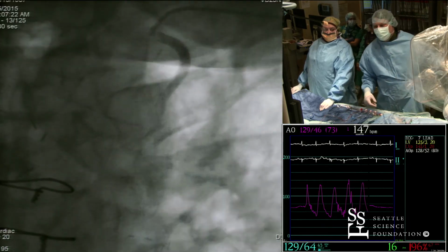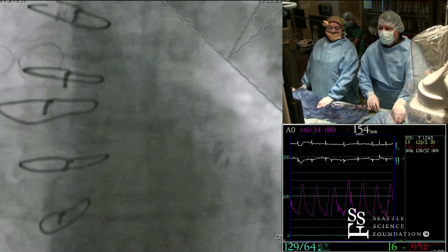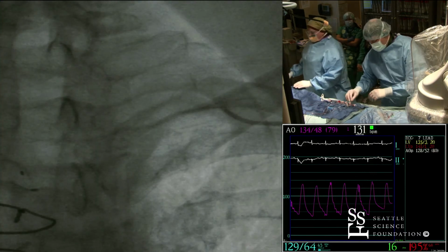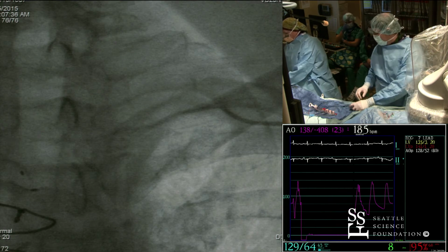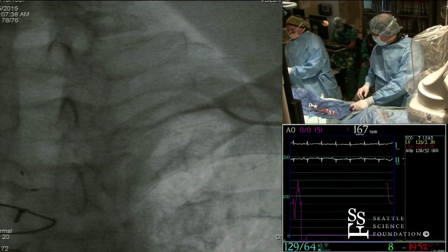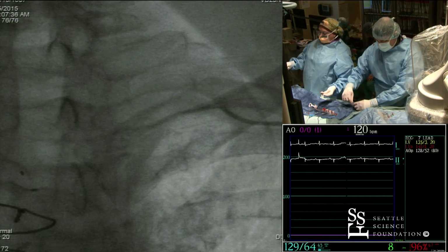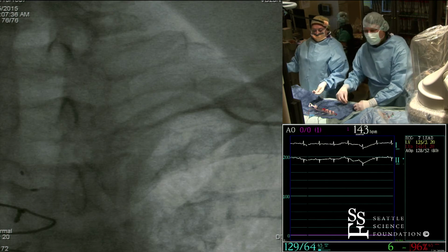All right. Okay. Pan up there, if you would. Okay, good. So let's have the wire. What I have learned through the years is it's better to take these catheters out with the wires. Even with something like the Judkins 4, you're not sure what you went through in the arm, and so I've always just gotten in the habit of taking all the catheters out with the wire, and I've learned that the hard way in a couple of cases.